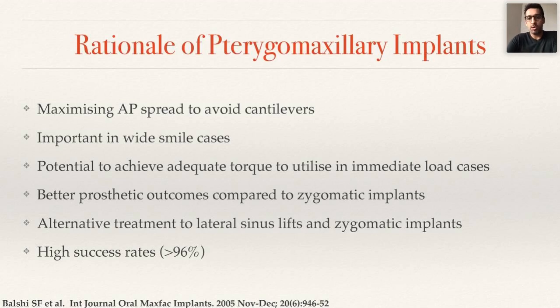It's an alternative to doing a sinus lift and zygomatic implants. So I'm not saying we're not doing sinus lifts. I'm saying pterygoid implants are an alternative to a lateral sinus lift. And we know that we get equivalent success rates in comparison to conventional implants, of 96%, and there's data in the literature supporting that.